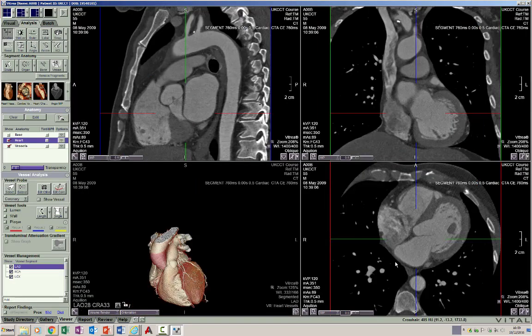I have loaded a cardiac CT angiogram which was performed as a triple rule-out procedure, and hence we can see most of the chest in this study besides the heart. So what is the long axis of the heart?